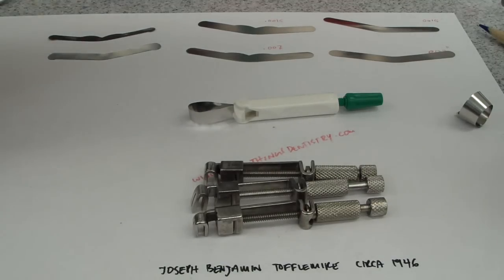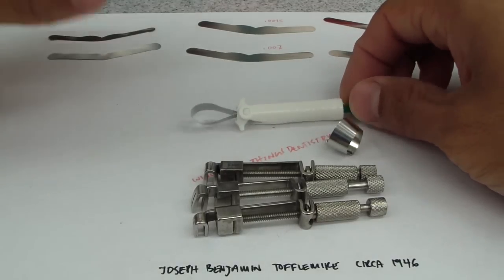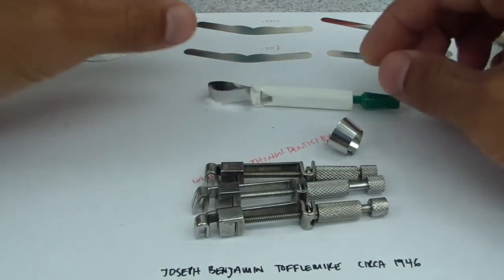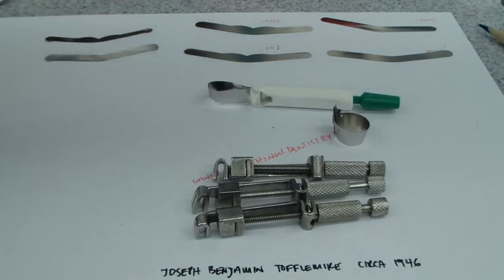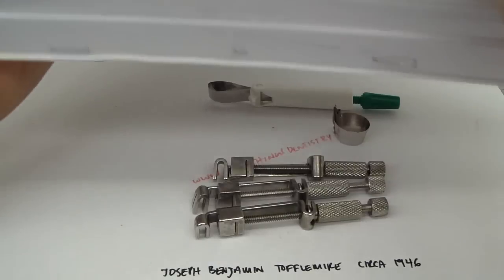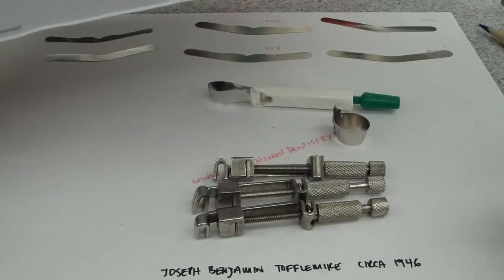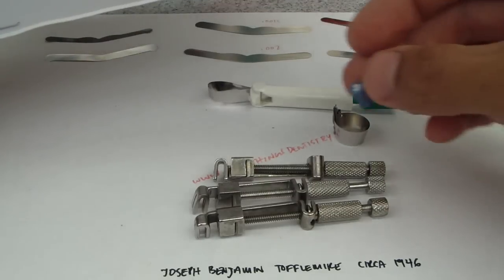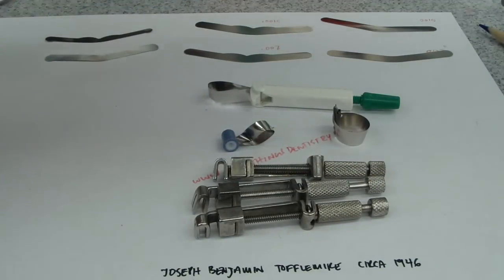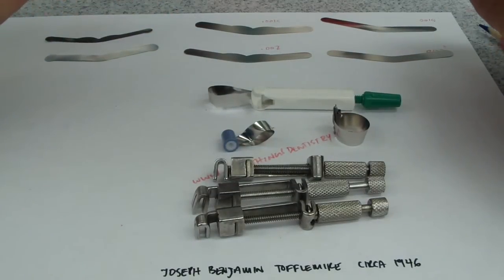A few neat things about the Tofflemire Matrix. There are definitely many, probably thousands of different brands out there. This is the Omni Matrix, there is the Auto Matrix, and I have another one here. There's a palodent, but that's difficult for complex. This is the Hawe Supermat — just another stainless steel matrix with some sort of a holder and a tightening system.